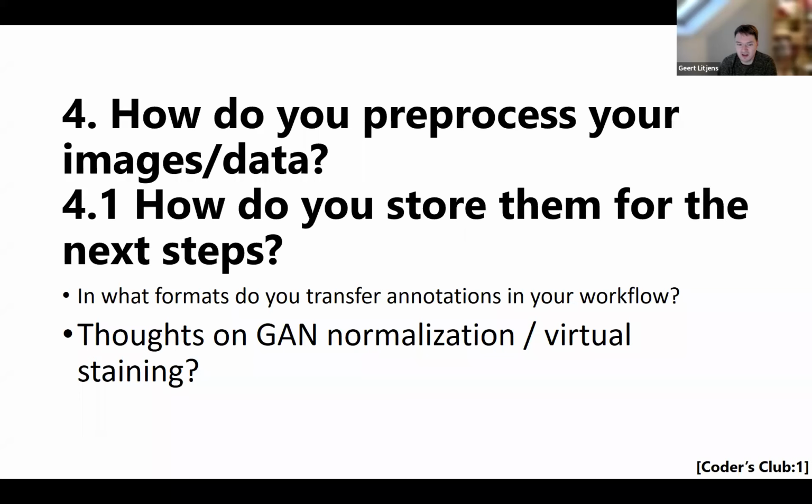So that's an aspect that traditional methods cannot fix, and generative adversarial models theoretically can. I do think that with GANs, artifacts can be a serious issue. We decided to try something different. So what we did in our paper is actually doing a residual GAN.